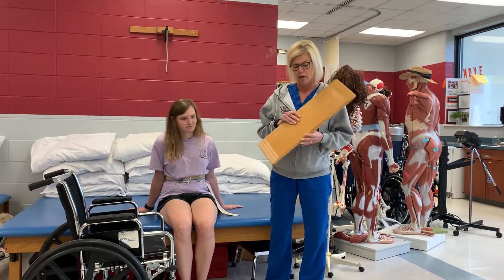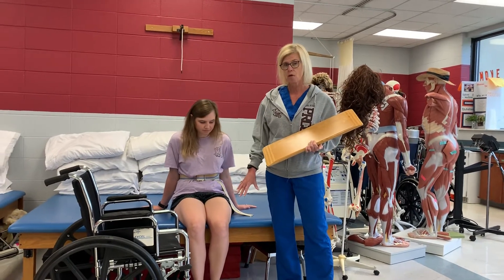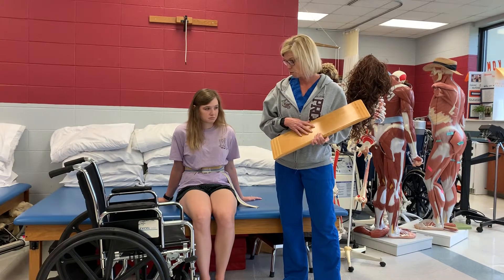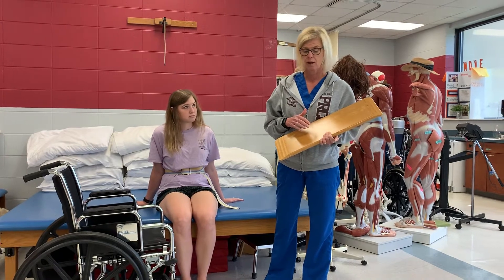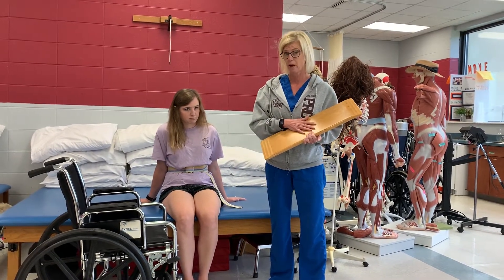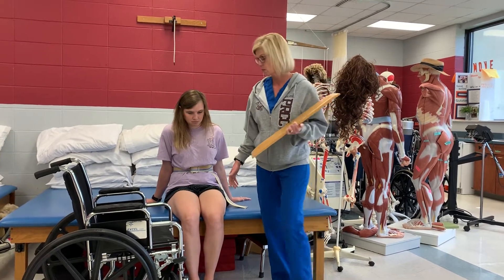This is a transfer board. We can use it for different types of patients — if they've got bilateral lower extremity weakness, we can use a transfer board with that. If they had a spinal cord injury and had some paraplegia, you'll see them use a transfer board quite a bit. Or if they just have one leg that's weaker than the other.